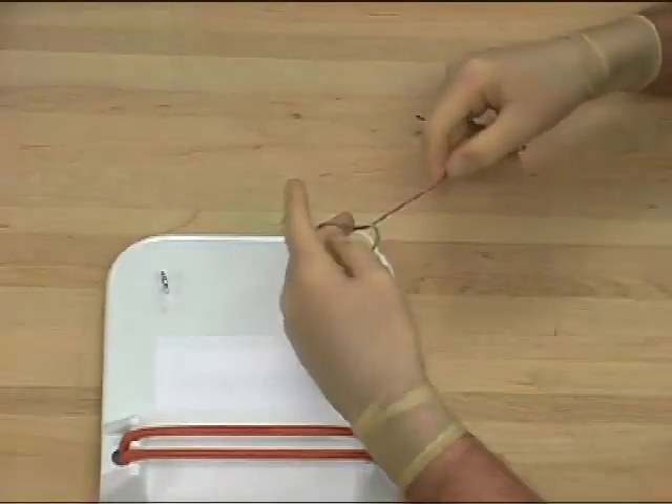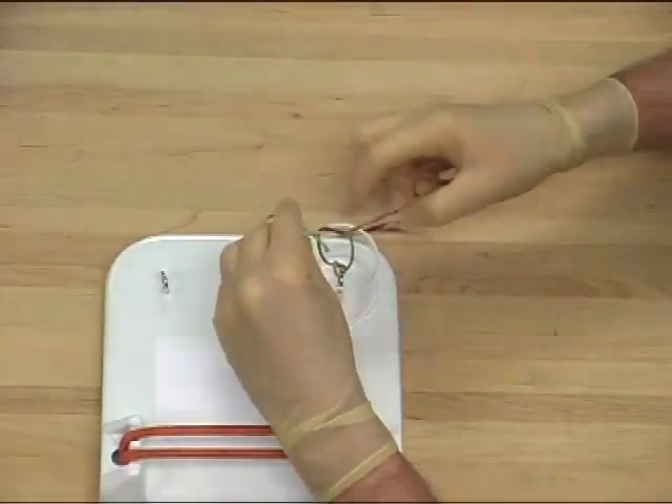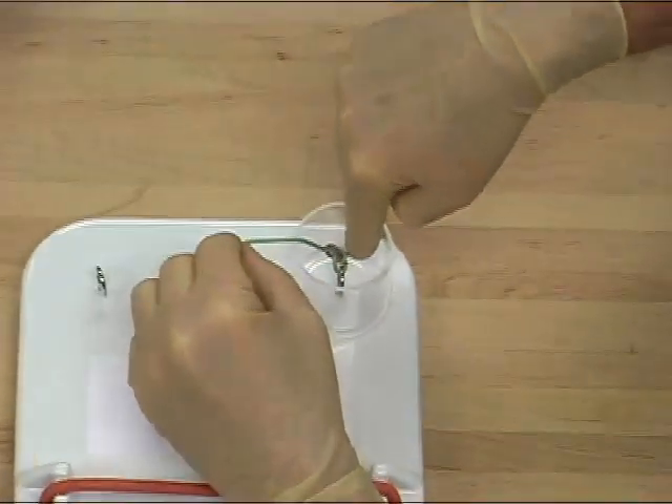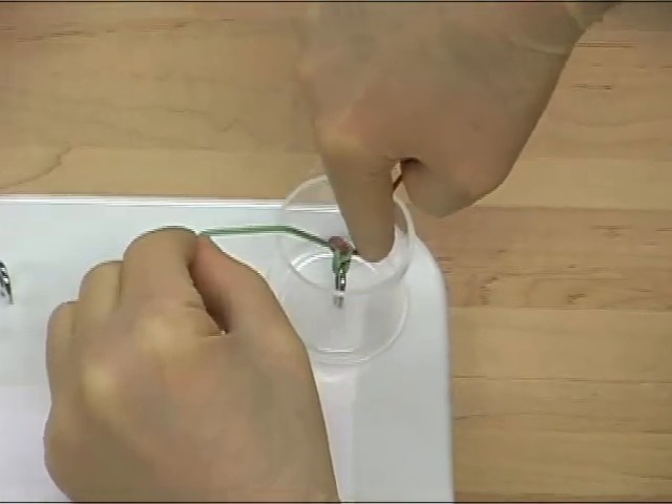The knot is then completed with a backhand knot, squaring and again placing the knot carefully to avoid any traction or pull on the structure being tied.